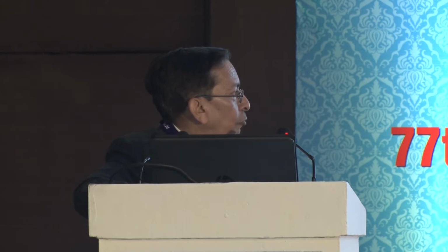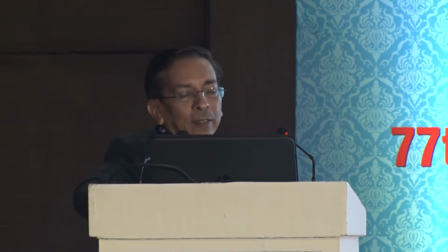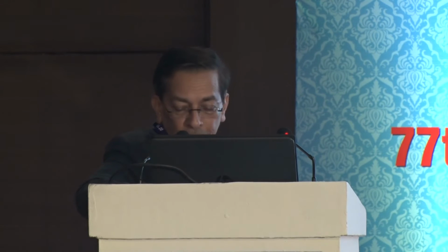And later on, if you feel that this opacity is still obstructing, you can do the posterior capsulorhexis here. So looking at the posterior capsular plaque, you do not directly go to removing the posterior capsule; you can try to keep the posterior capsule intact as much as possible.